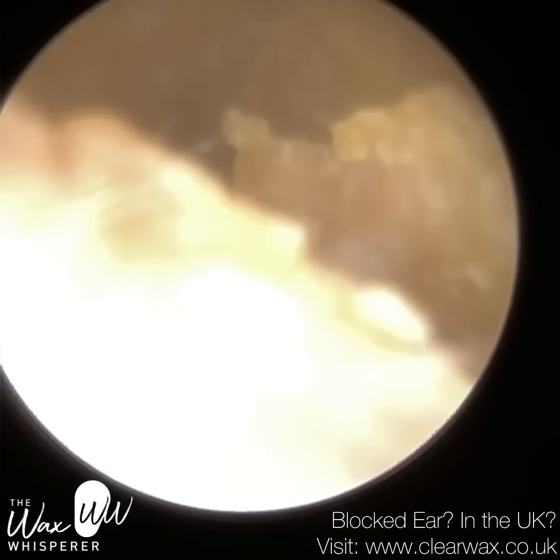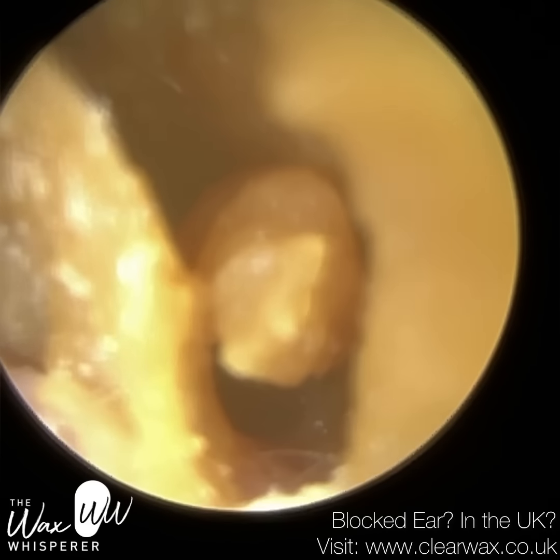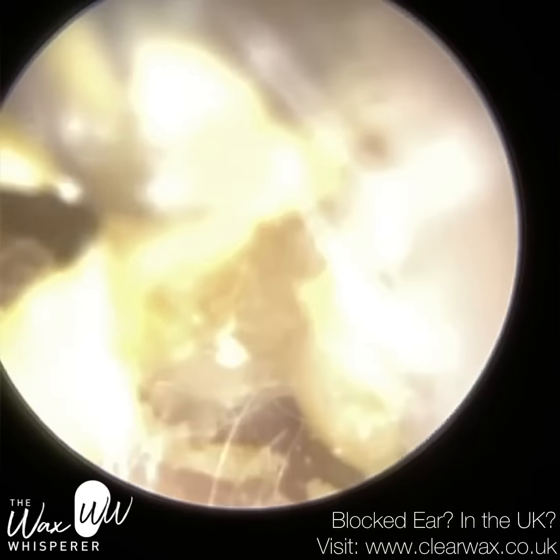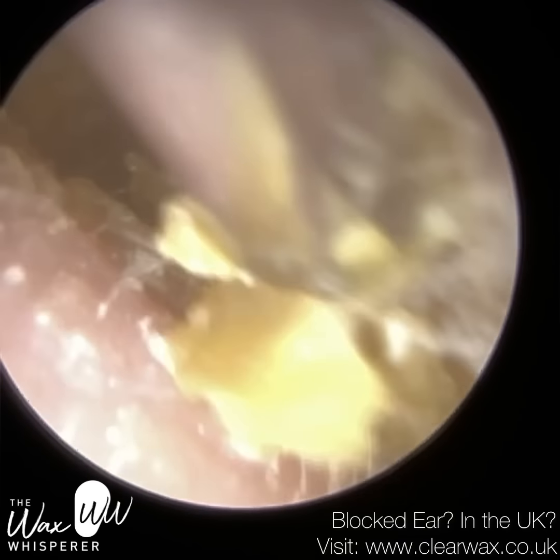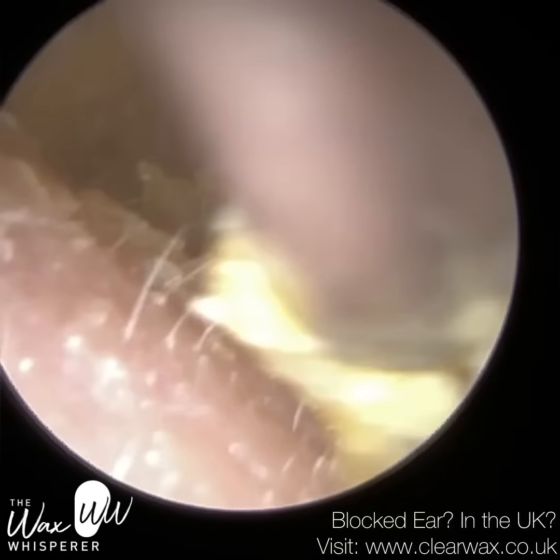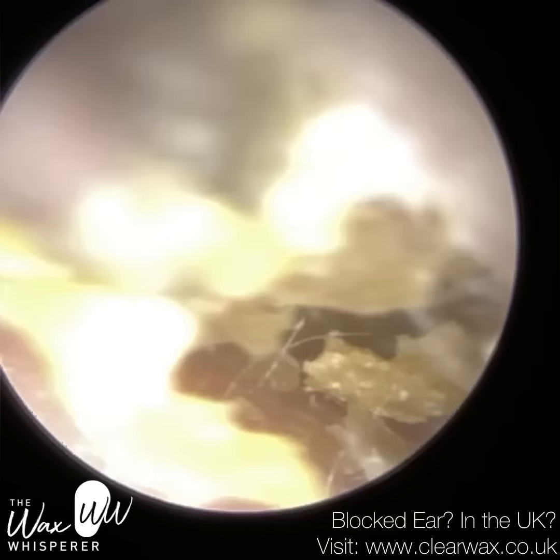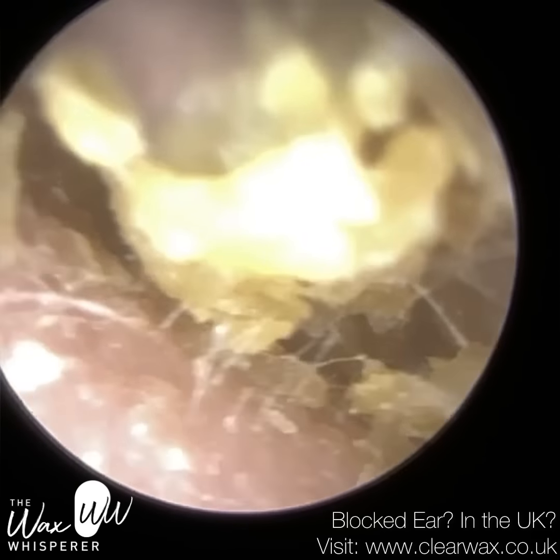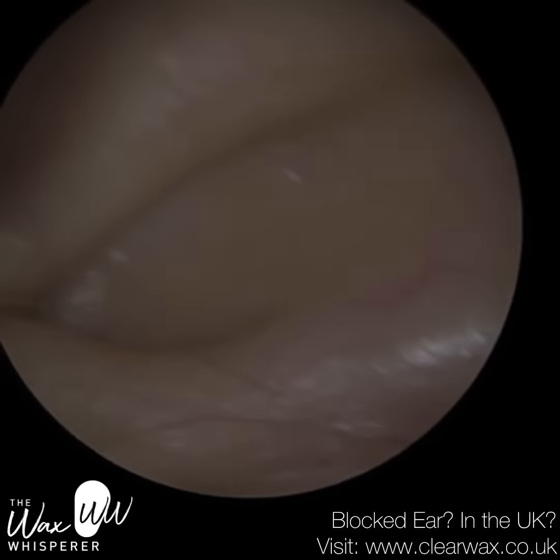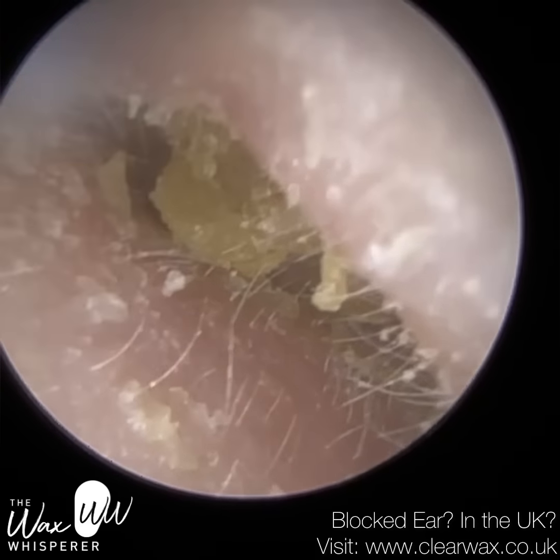I can only think, as I was bringing it forwards, you can see that we weren't in contact with the canal at all. You can see the keratin at the base there. So it would have just been that some of these adhesions are quite strongly attached to the canal side walls, and as I was bringing it through, you could feel it coming away. You can see this is really dry. This is a kind of a class 2, type 2. It's really crusty.